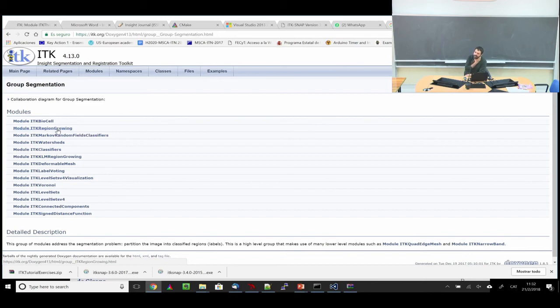It's an algorithm used in one of its applications in phase unwrapping. Phase unwrapping for MRI images, and it's used like you put a seed, and this seed will grow dramatically to cover one area you're looking for. Everybody remembers this? Or you've done that in... This was like a project.